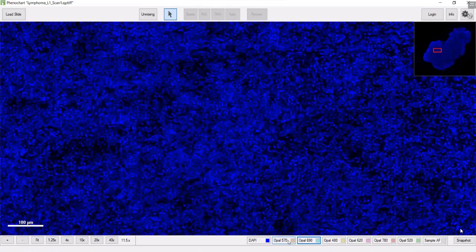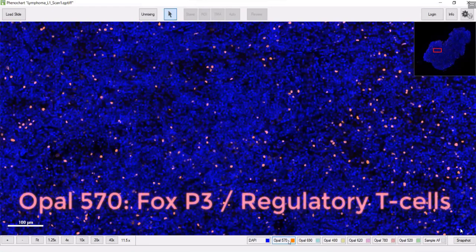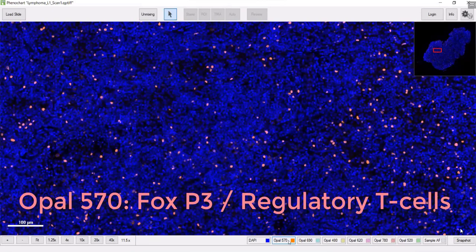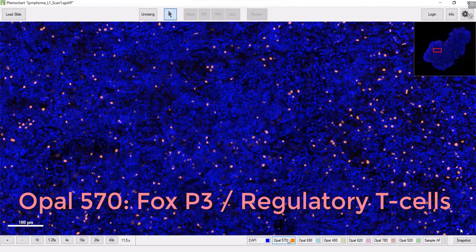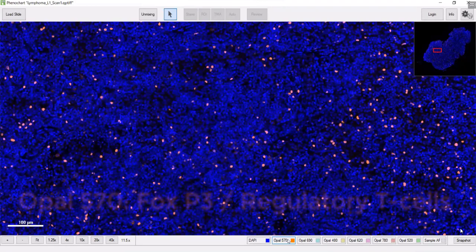Other markers in this panel include FOXP3, so those are probably all regulatory T-cells. Notice how clean the signal is.